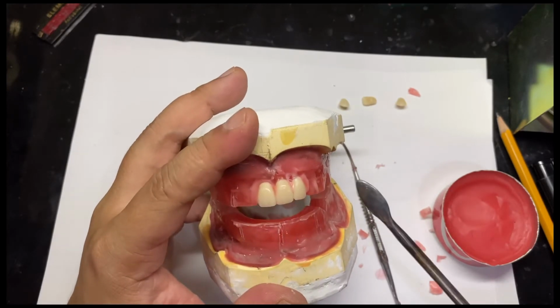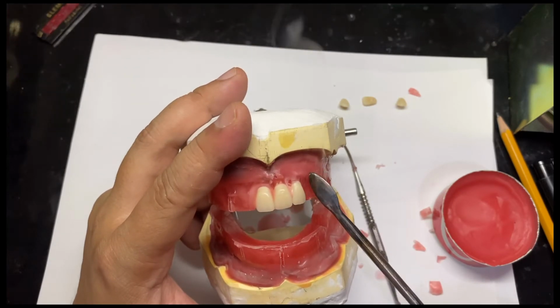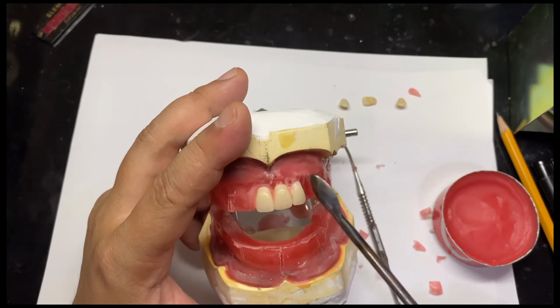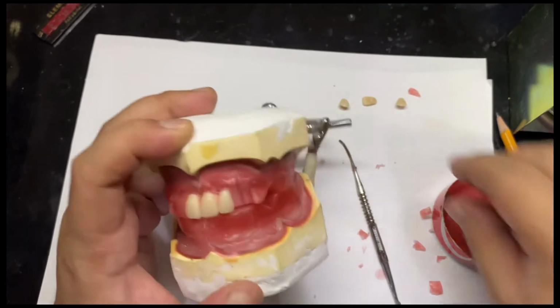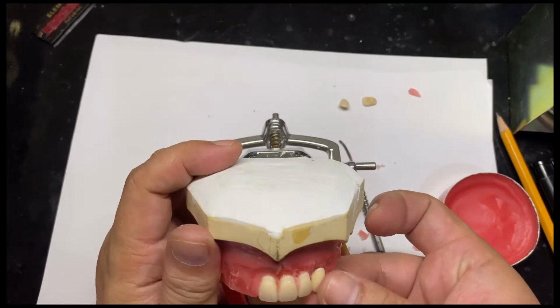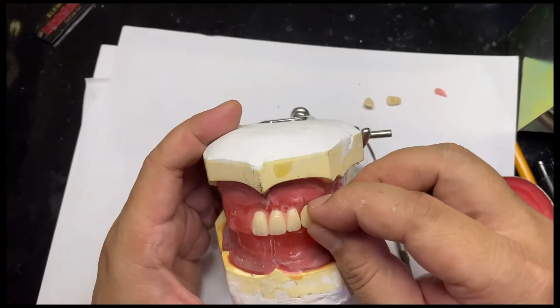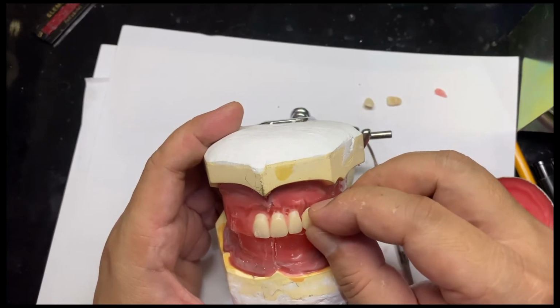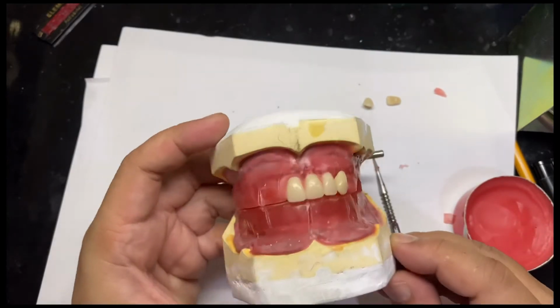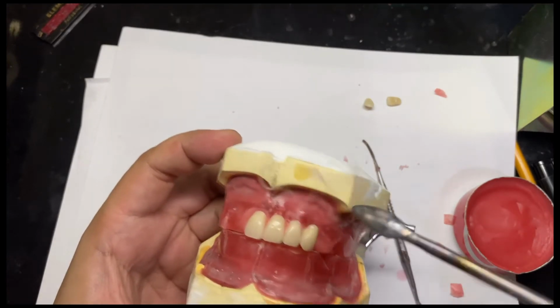And of course, the canine. Canine should be set neck out, incisal third in, and then the incisal tip follows the occlusal plane. There. And then again, you have to seal the cervical portion.